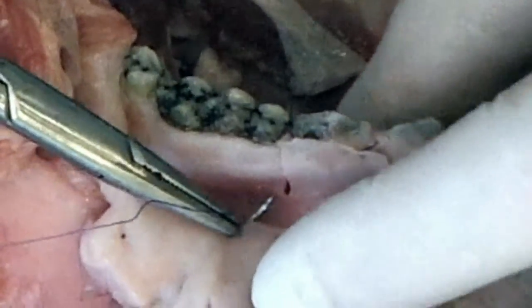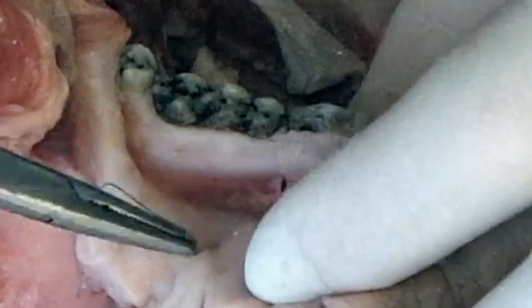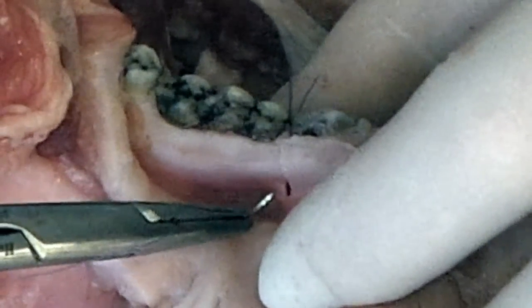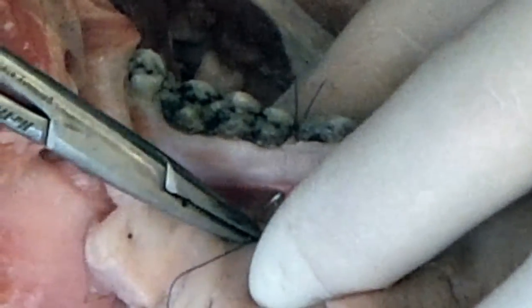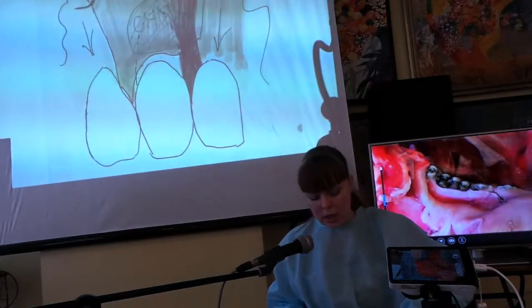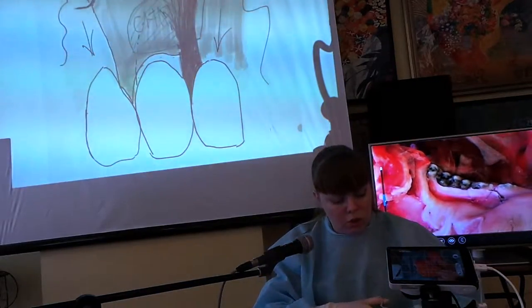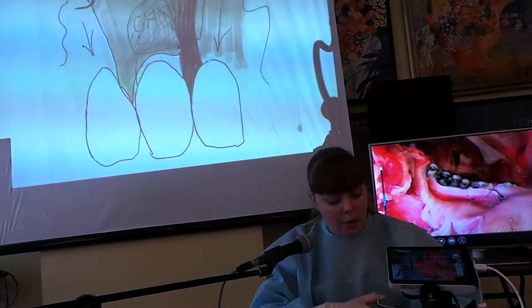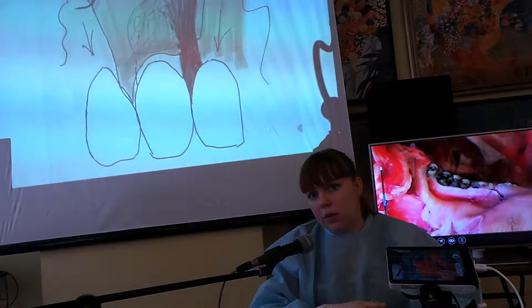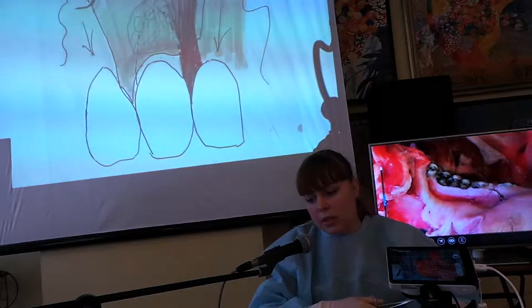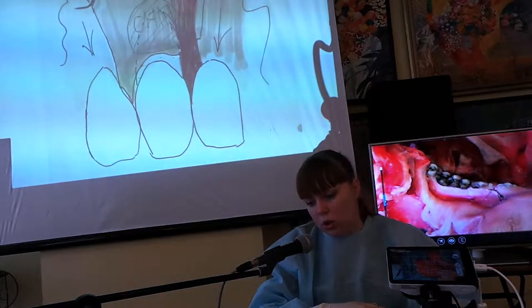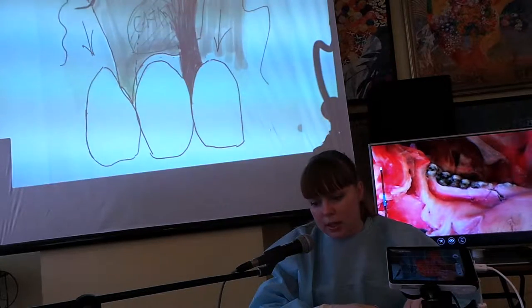И фиксацию мобильного лоскута, выполнив его фиксацию к надкостнице субнадкостничными швами. Выполнив коронарное смещение, мы получили объём слизисто-надкостничного лоскута с шириной кератинизированной десны около 3 мм в области рецессии.